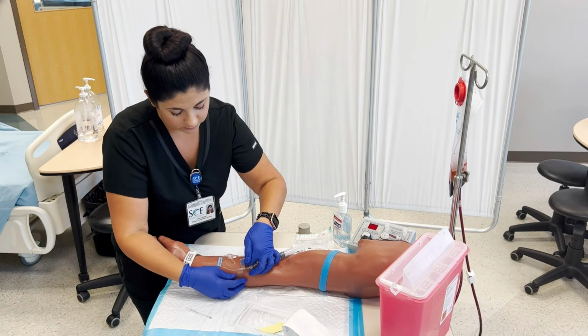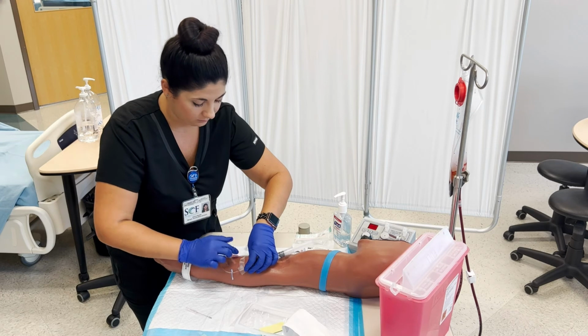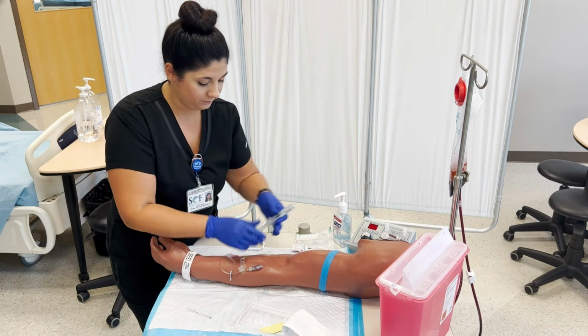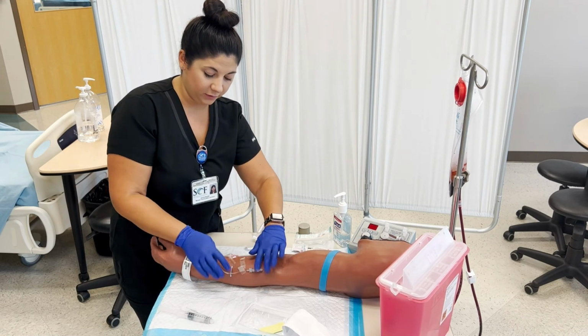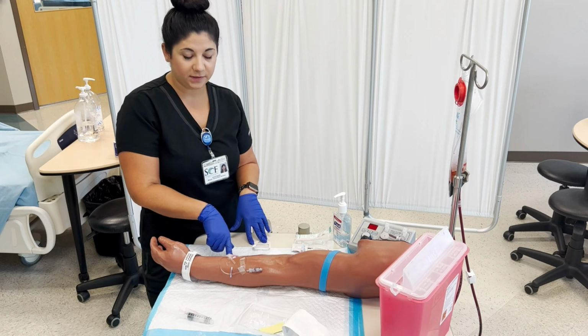I pinch it a little bit so that it's not pushing right on my patient's arm. But it's secured on there. Clamp this if you don't have any fluids running through it. And then I will label it with my initials, the time and the date that it was inserted.